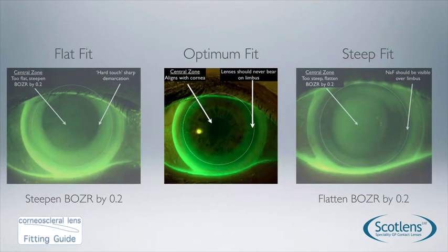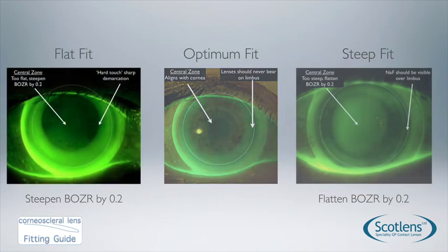For a non-optimal flat fit, you can see the lens has a large edge lift and there is hard touch — a sharp demarcation between the central alignment and the limbal clearance. Patients will generally be more edge-aware with this lens and comfort will not be as good. If you see a lens like this, select a base curve steeper by 0.2mm and reassess.